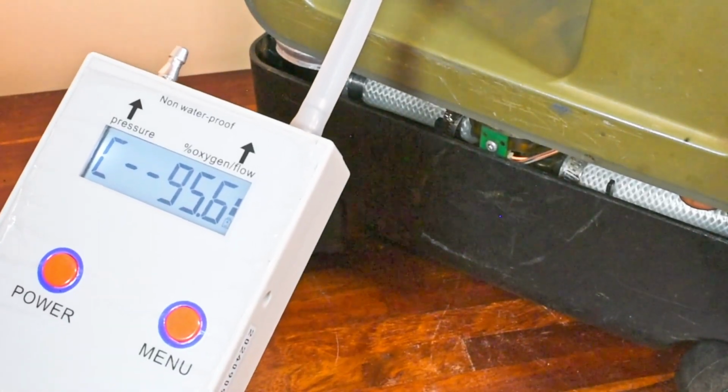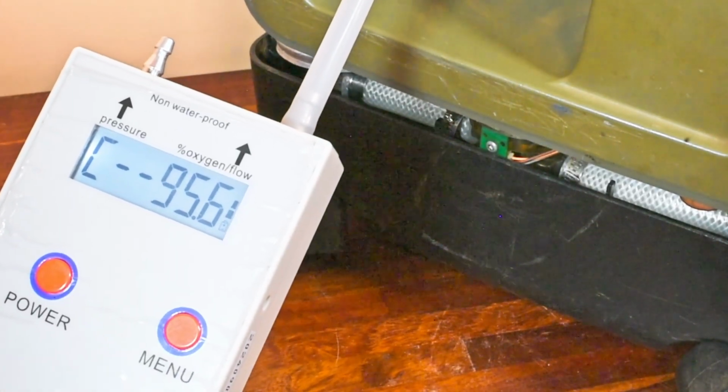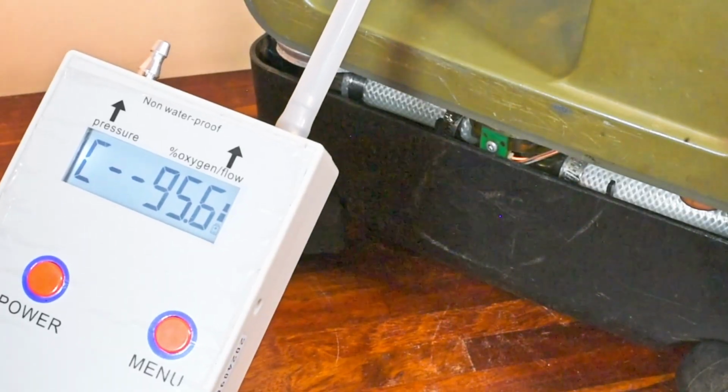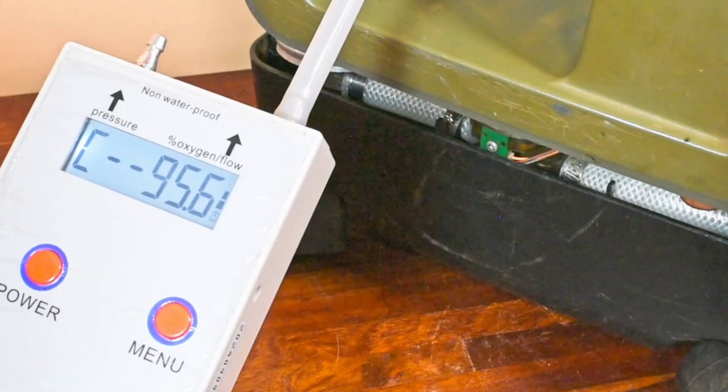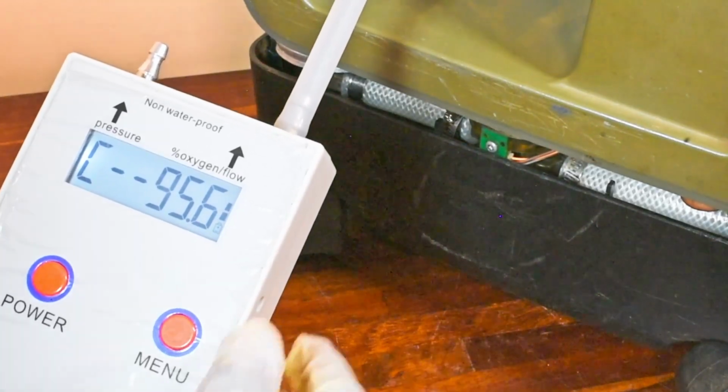So as you can see, the measured oxygen purity is 95.6%. So let's see what would happen to this concentration if we reverse the direction of the check valve.